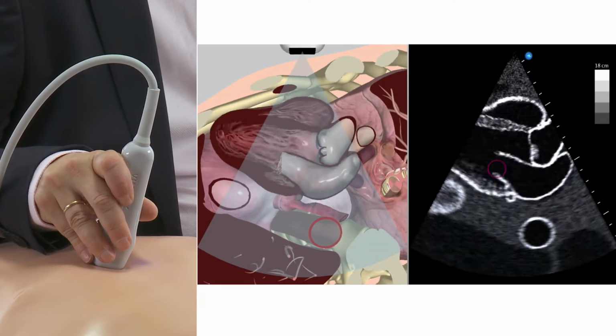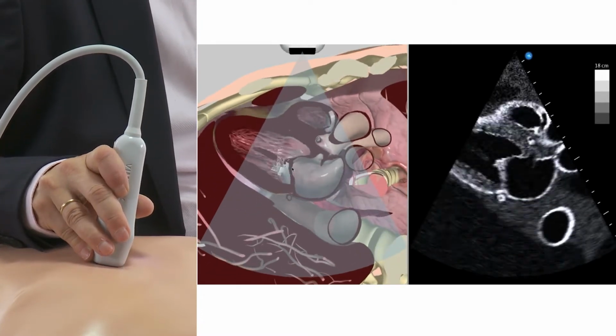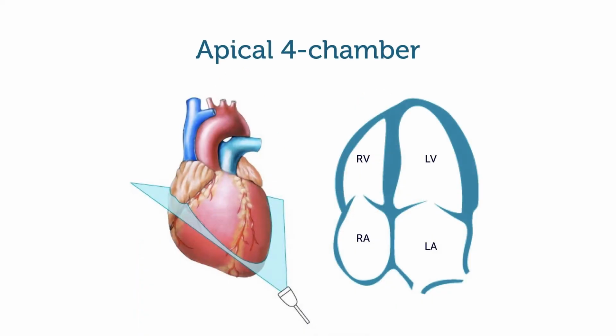If you want to see the entire mitral valve, you have to slightly tilt the transducer to scan through the entire mitral valve. All these views were parasternal long axis views, but there's another view which shows you the mitral valve in detail, and this is the apical four-chamber view. You're really familiar with it, but let's go to the machine anyway and see.